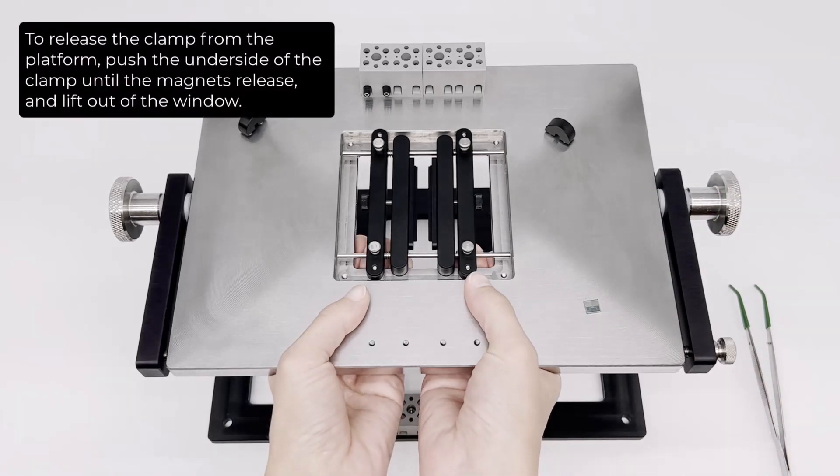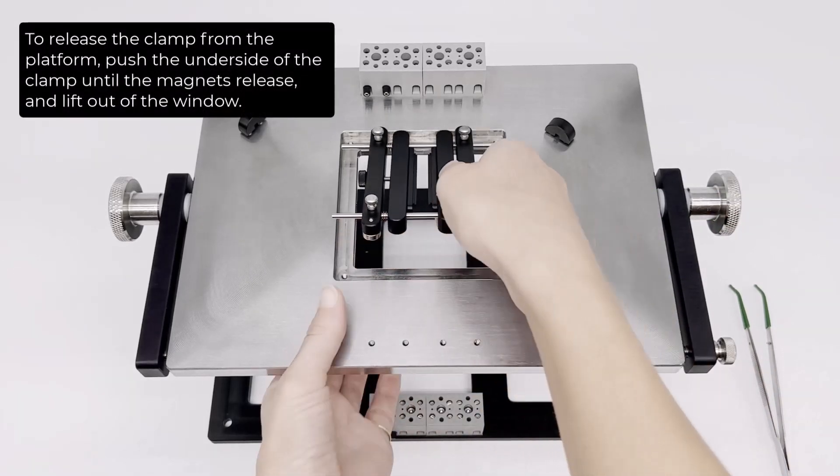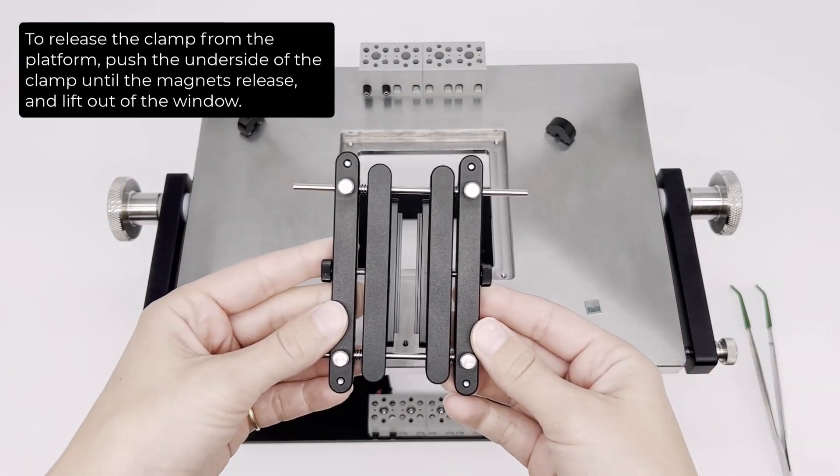To release the clamp from the platform, push the underside of the clamp until the magnets release and lift out of the window.